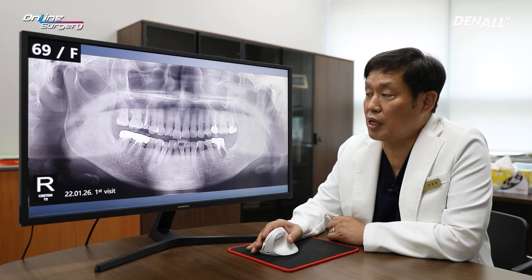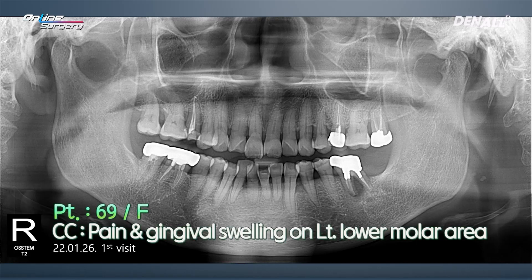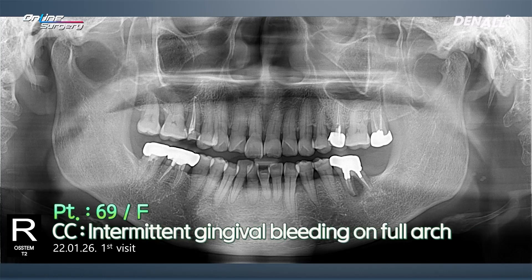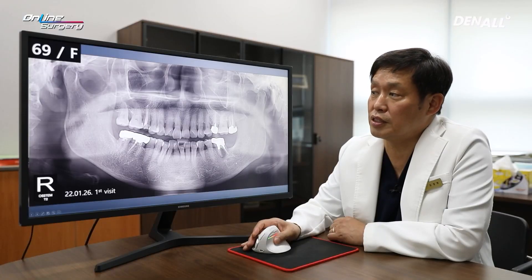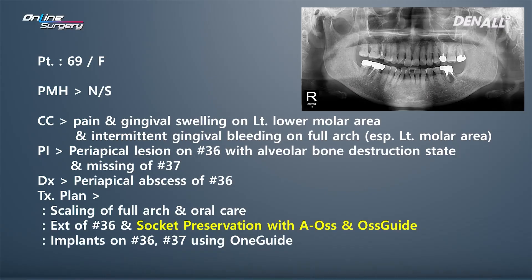If you look at the panoramic image at initial visit, the patient complained of pain and gingival swelling on the lower left molar area. The patient also complained of intermittent bleeding, especially in the lower left posterior area. That was the chief complaint.